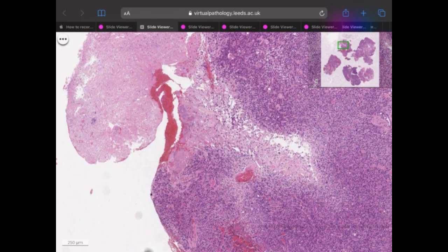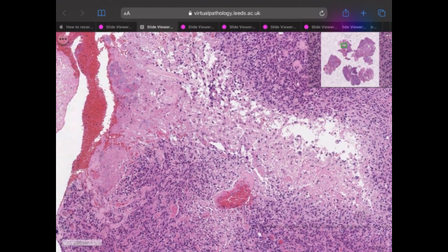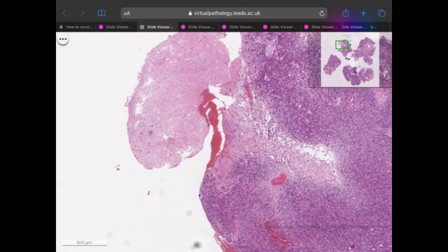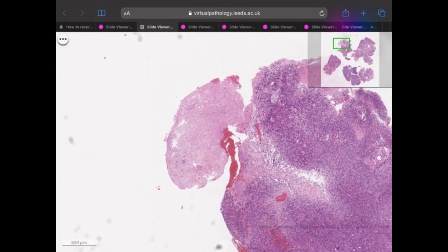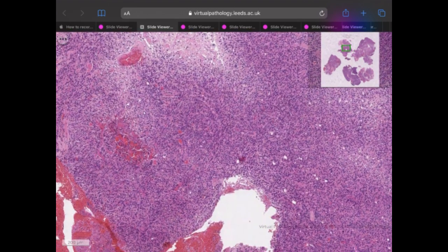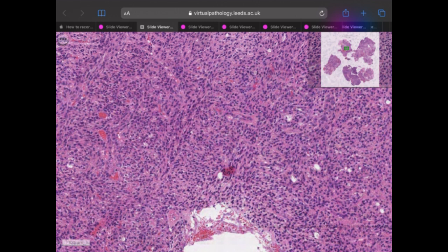Let's see another fragment of this tumor. Here, you can appreciate the large area of necrosis. This at the center is necrosis. This is another necrotic fragment. They are very cellular. It appears very blue because of the cellularity. It is well vascularized. You can see many blood vessels.